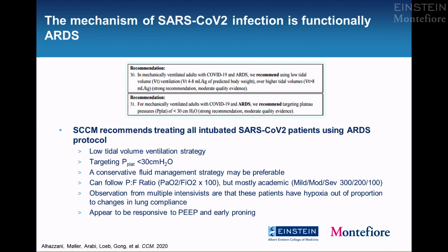So the reality of managing COVID-19 at present is that many of these patients who require intubation are being managed in an unconventional or non-ICU setting, so on a floor, on a monitored ward that's not really an ICU. And so the reality is that many providers are going to be providing care to these intubated patients in a floor setting. So I think it's very helpful to understand how we approach mechanical ventilation in these patients with some degree of ARDS and COVID-19 infection.